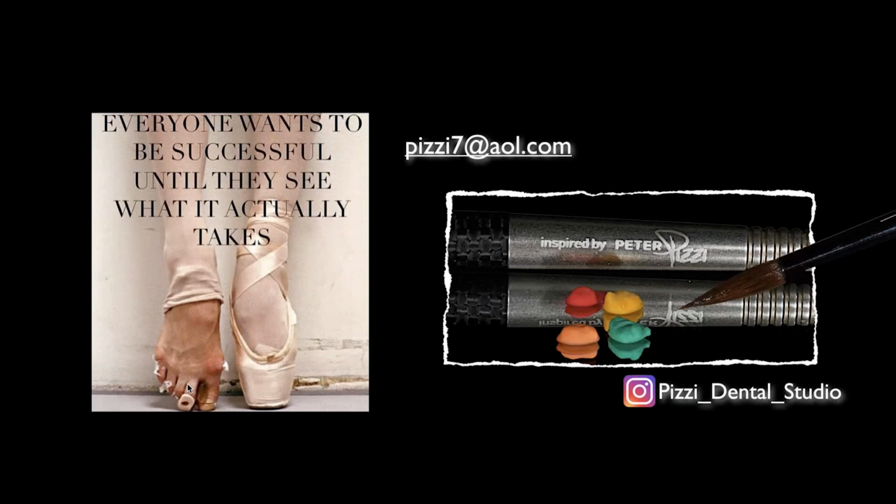And then you showed a picture there that showed the paste. The question was, if you add your glaze onto your texture and you have too much glaze, do you just start over, recorrect it, retexture it, and then use a light thickness of glaze at that point, or make it deeper? I get what you're saying. I try not to use too much glaze, and that's why I showed you breaking the glaze down, right? Using a finishing agent in it or breaking it down a little when you're really trying to show surface texture.